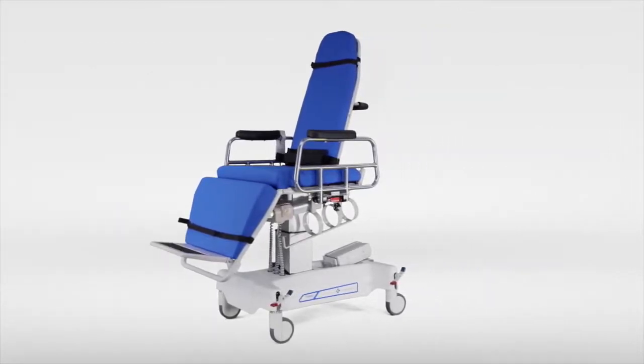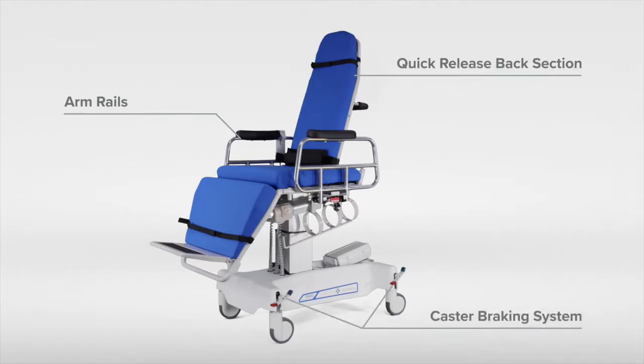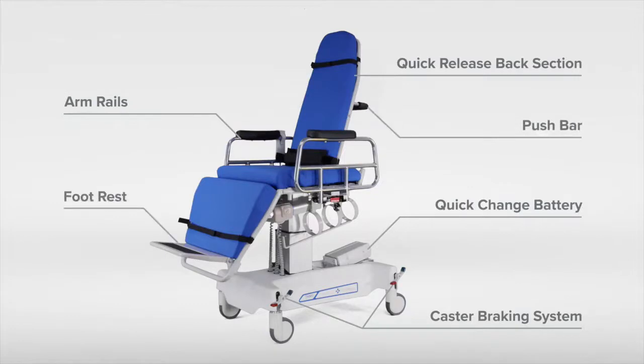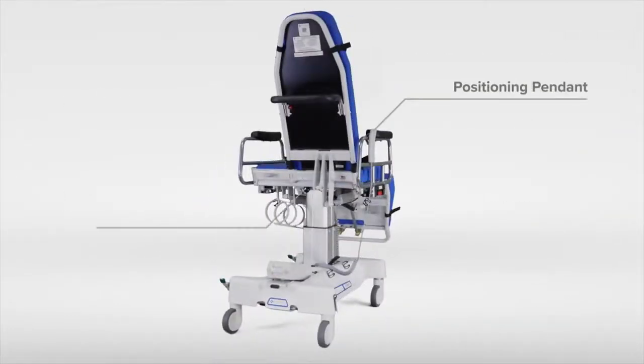The main features of the chair include arm rails, a quick release back section, caster braking system, quick change battery, push bar, footrest, pendant positioning, and a seat lock knob.